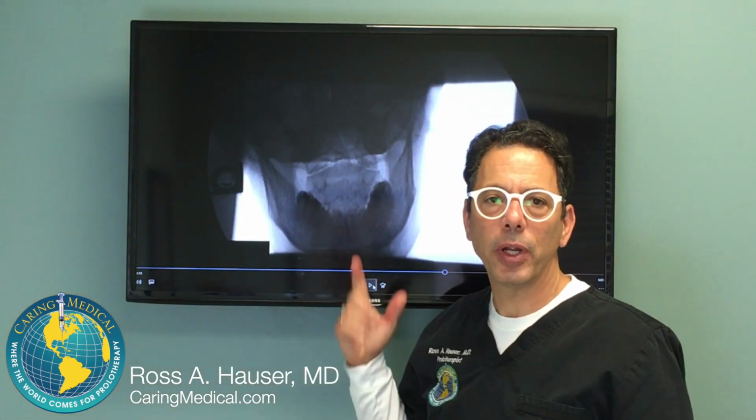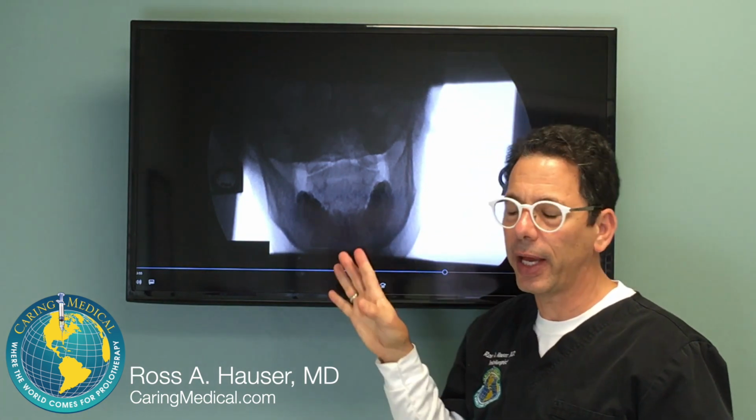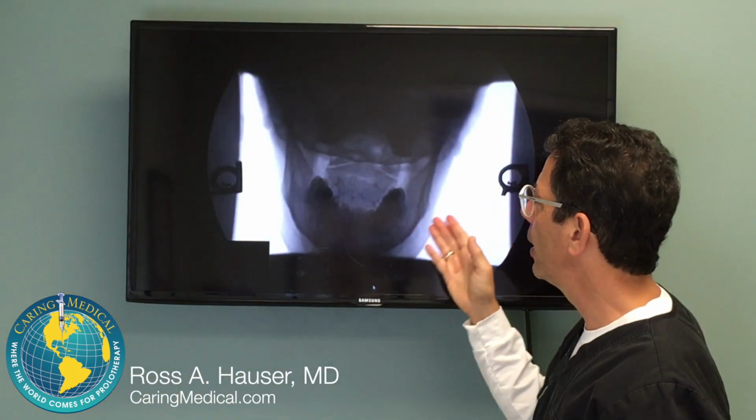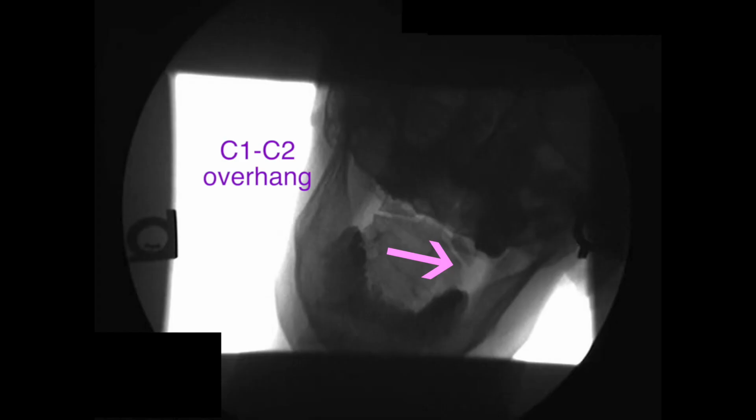Now let's look at her C1, C2 facet joint and connection, and we do that through the open mouth view. We're going to watch Brittany's open mouth view to look at C1, C2, but I should preface it by saying that she was so locked down when she came in, like there was actually no movement. So even the movement you're going to see is after her suboccipital muscles were numbed. And you'll see that she's very hesitant to even move, just because she has so much instability, but the body is clamping the muscles down so the C1, C2 doesn't hit vital structures such as the vagus nerve or the spinal cord. So you will see some overhang. You could stop. You could see the overhang right here. That's the instability on the right side. Then we'll do the left side.